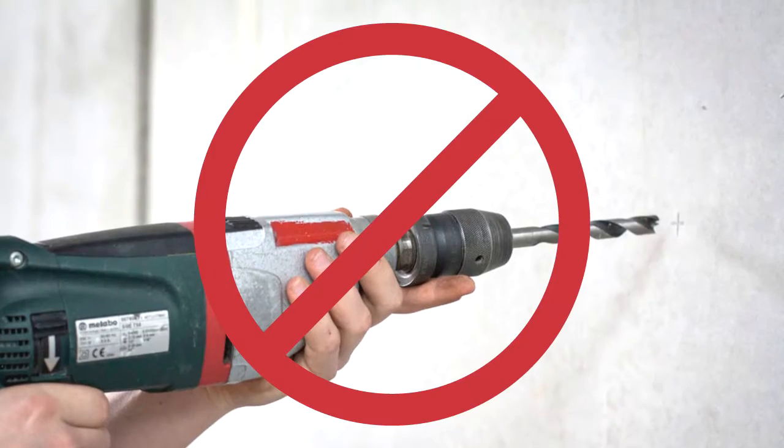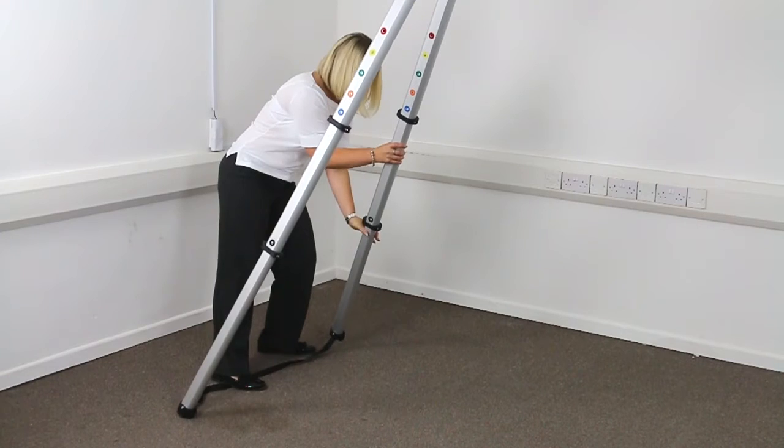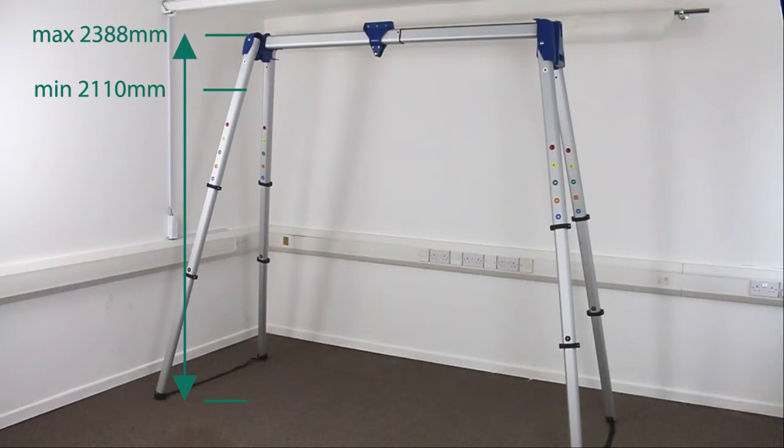The portable gantry requires no drilling or fixing and can be easily assembled by one person in a matter of minutes. By aligning the coloured indicators, the height can be adjusted as required.